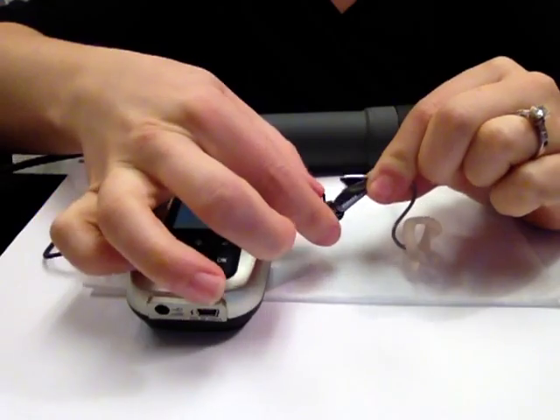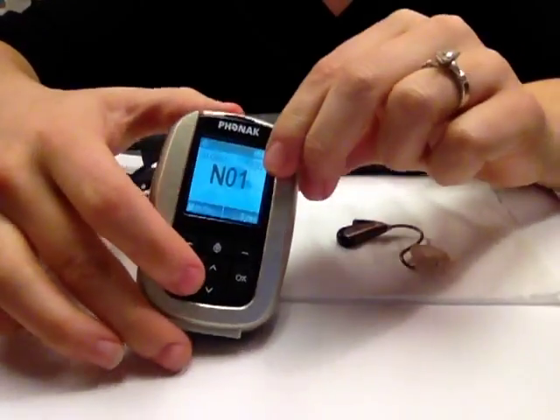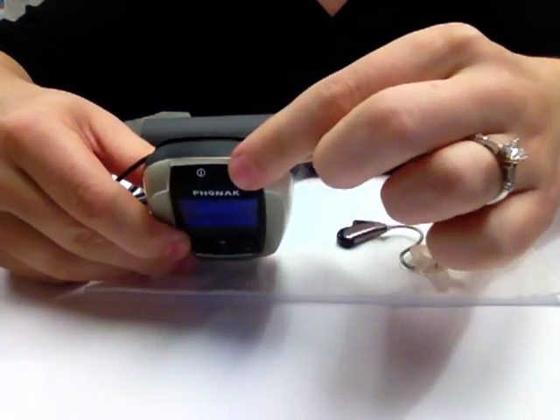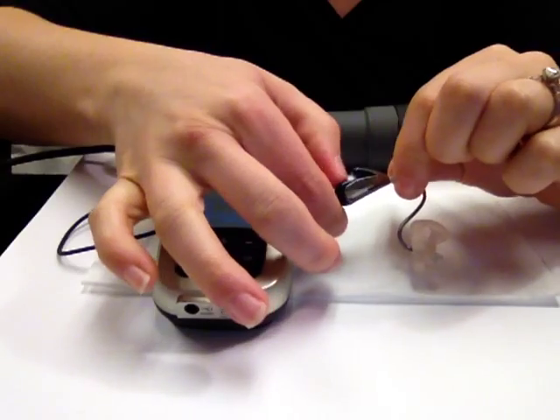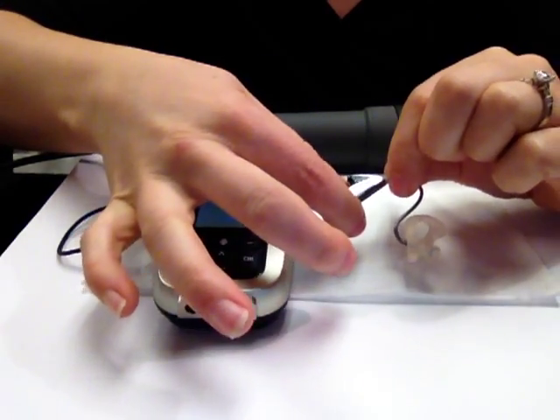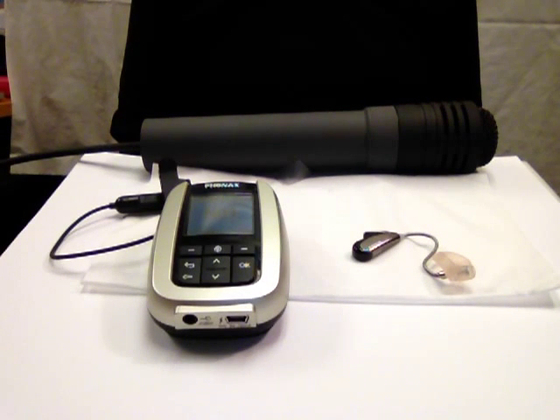If you still do not hear your voice, turn off the transmitter and the receiver and repeat the entire process one more time. If you still don't hear your voice, contact your audiologist. What you cannot do is rely upon your student to tell you if the receiver is working. If the student says that it is not working, you'll need to run through the steps as we've outlined them in order to determine its functioning for yourself.